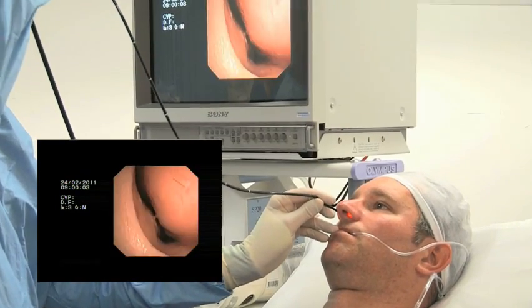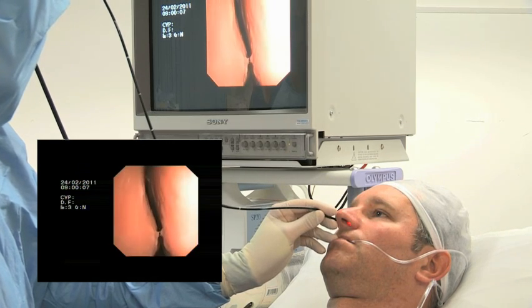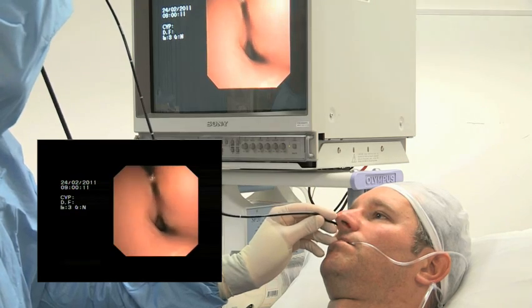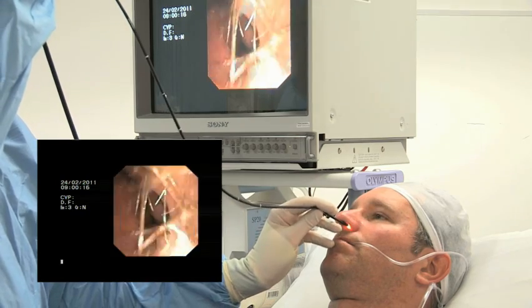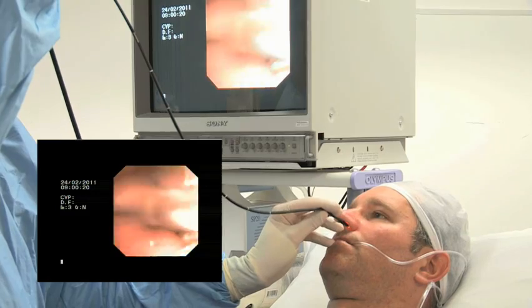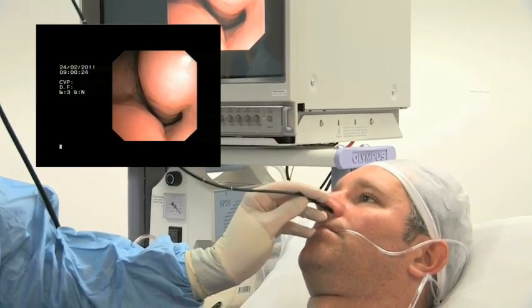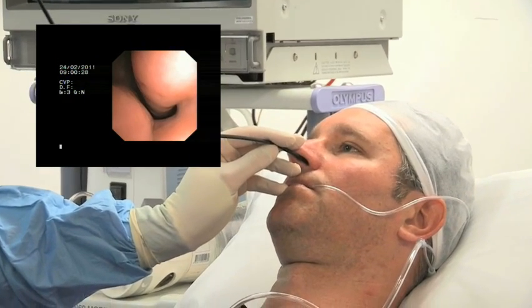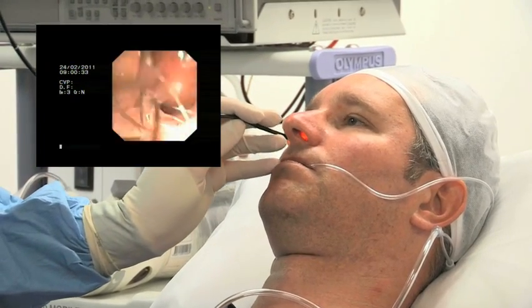The preferred route for passage of the fibroscope through the nose is between the inferior turbinate and the floor of the nose. When comparing the two sides, it can be clearly seen that the subject's right nostril has a wider passage through this area than the left nasal route.